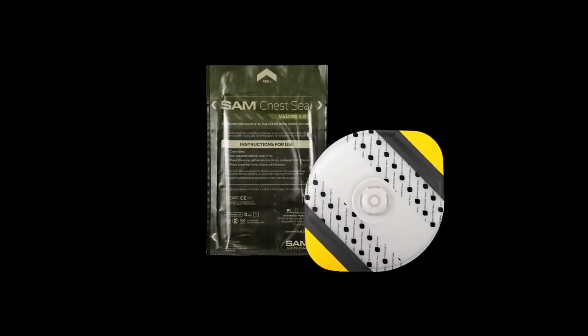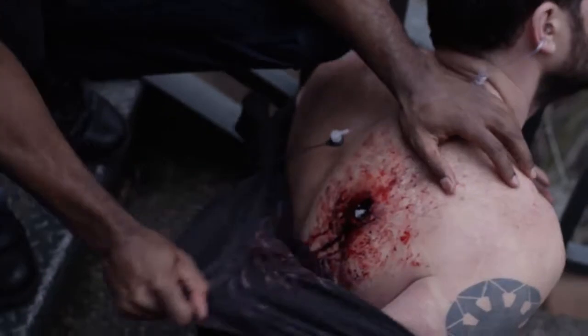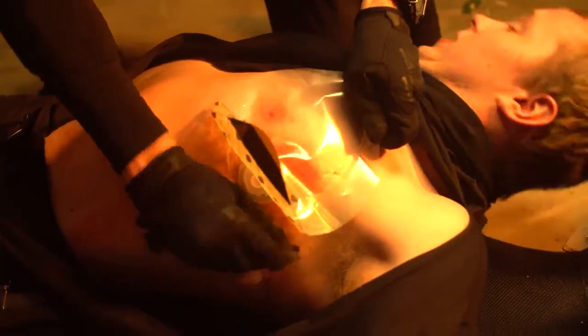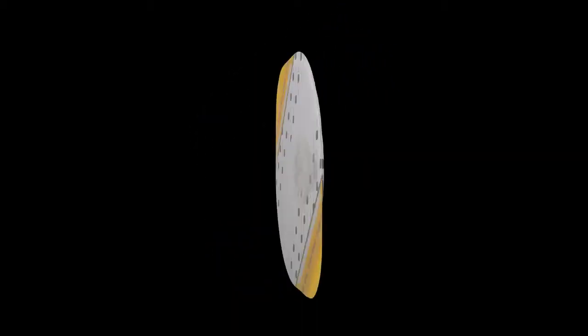This is the SAM Chest Seal Valved 2.0 by SAM Medical. SAM Chest Seal Valved 2.0 includes one valved SAM Chest Seal.